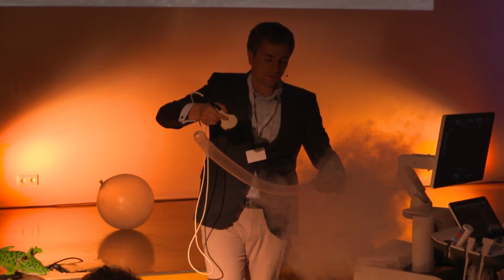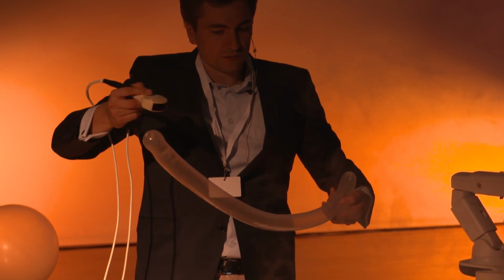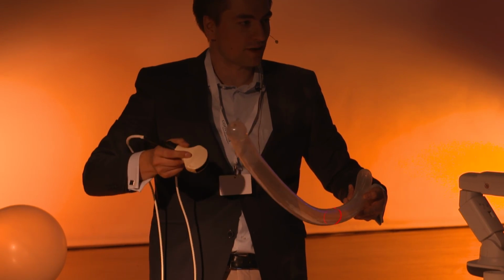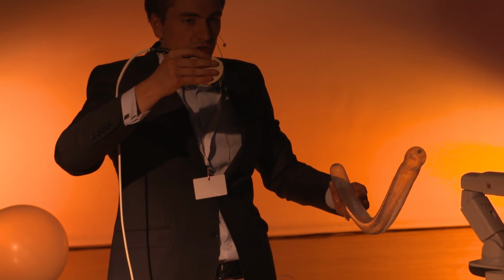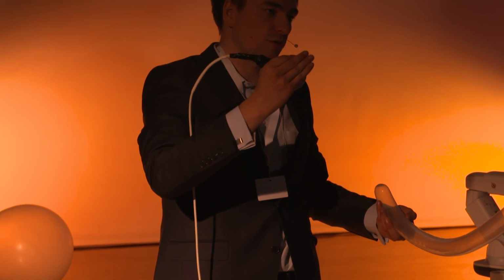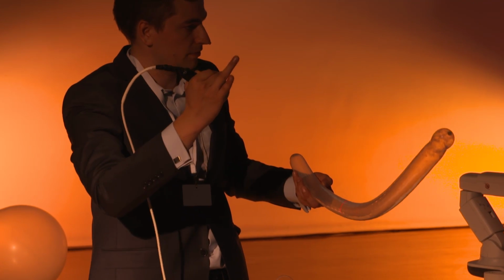Like the ultrasound beam is advancing, and I'm scanning through this vessel. And if I'm just moving the probe in all three axes at the same time, it won't work at all. I really have to face, and this is the most important thing you will learn right now, you have to grab your probe really at the bottom, get some skin contact so that you don't slide away easily.